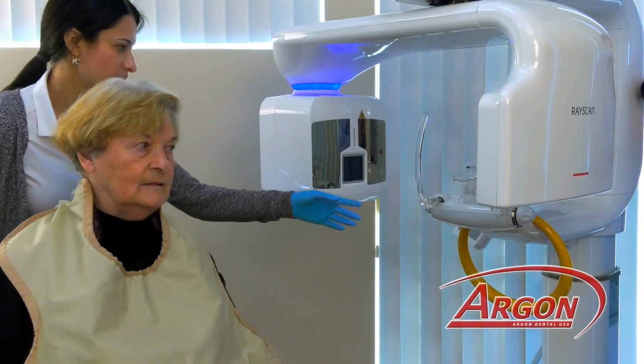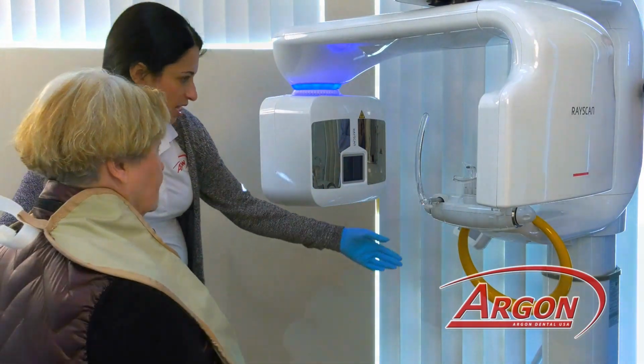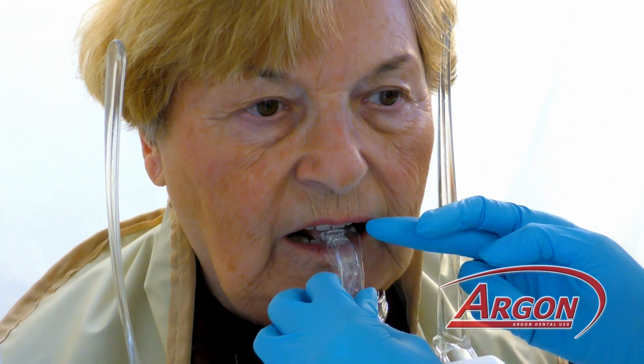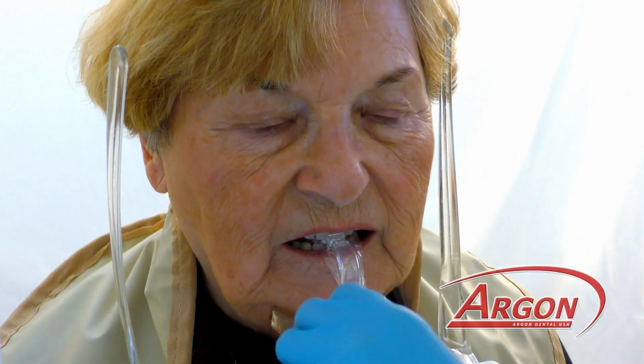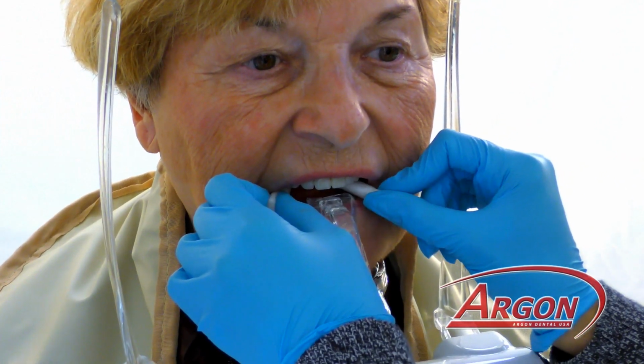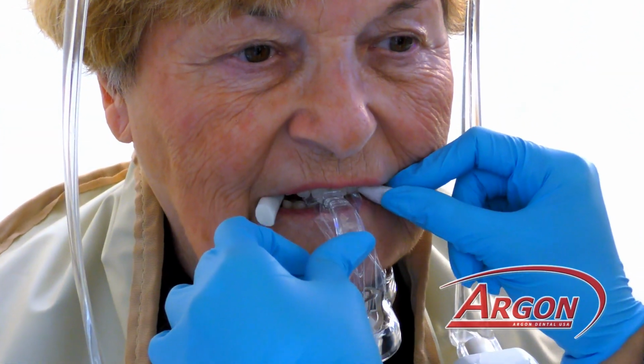With the scan, we have the patient seated. Patient is inserted into the chin rest and using the bite stick. Cotton rolls are again used to separate the two arches, and the centrals are positioned within the V of the bite stick.